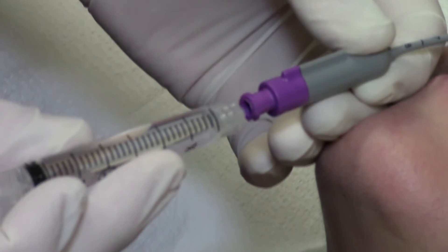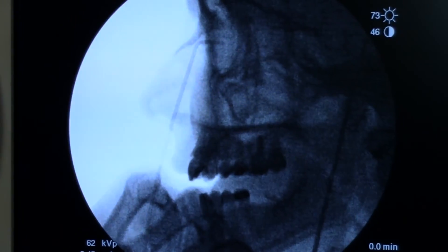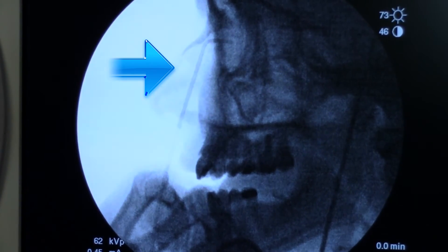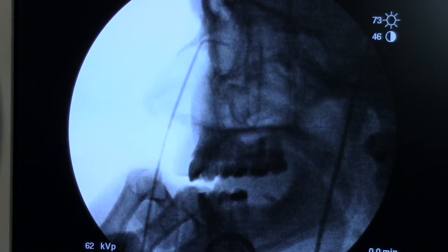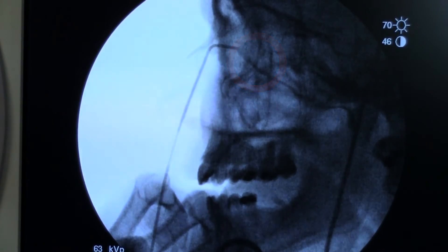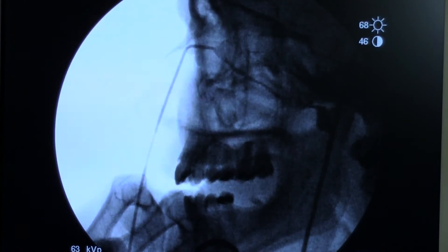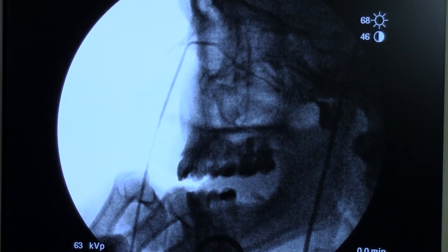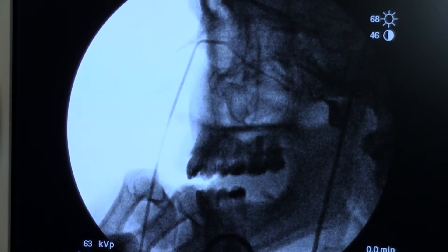I am going to attach the syringe with contrast to confirm the placement of the sphenocath. I am going to inject a small amount of contrast, and we can see it traverse the middle turbinate to the pterygopalatine fossa, where the sphenopalatine ganglion lies. We can see the contrast flowing right to the pterygopalatine fossa.